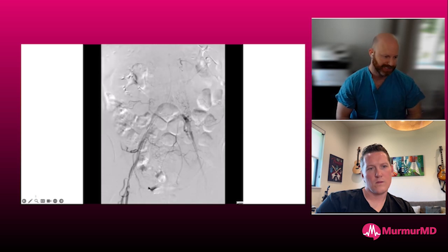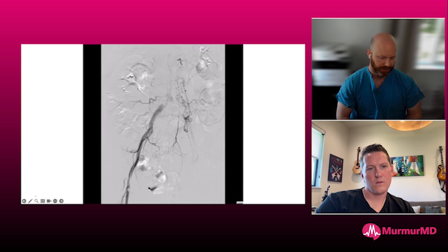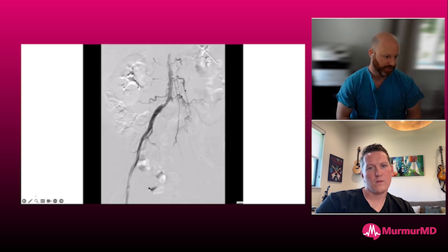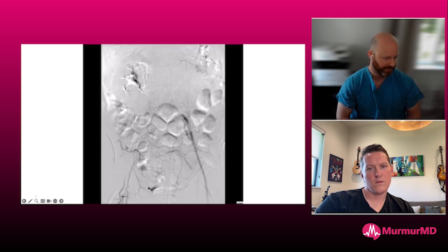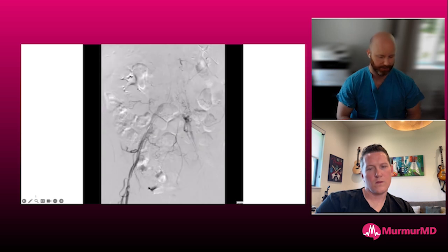And I've been increasingly changing the angulation from being sort of the 10 and 2 to more like 11 and 1 or less. I think you get less pinching of the arteriotomy, but just as good a hemostasis. In this case, it was probably a 10 and 2 because you can see that there's a little pinch in the CFA. Nothing that's going to change anything for her dramatically, but it's still something that you see when you take these closure shots.